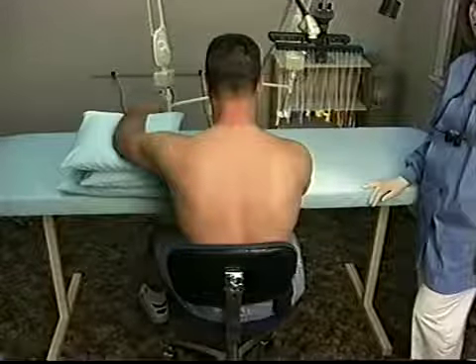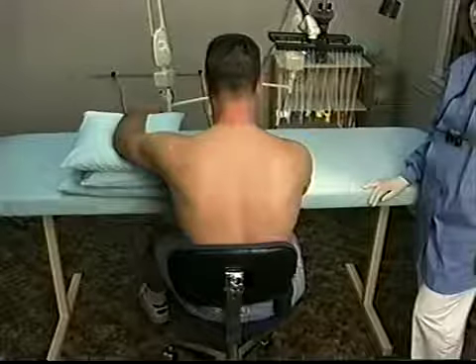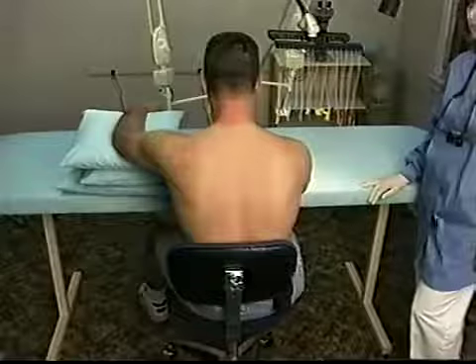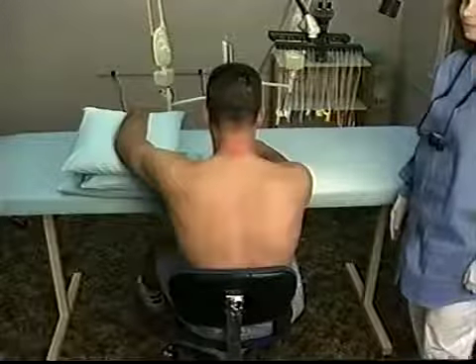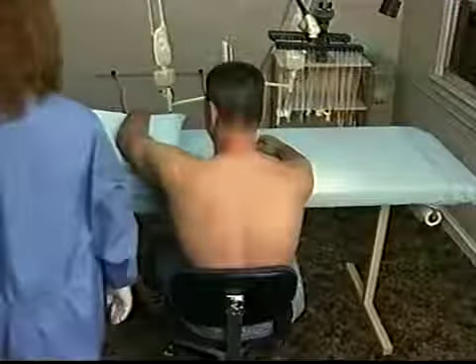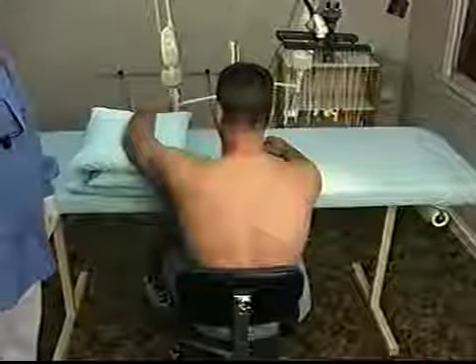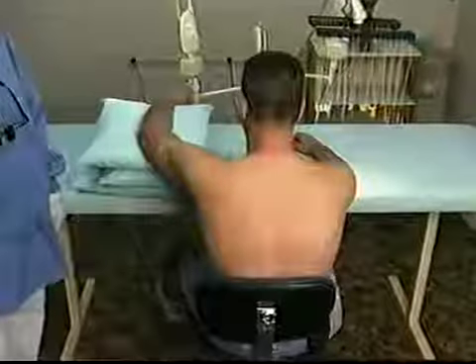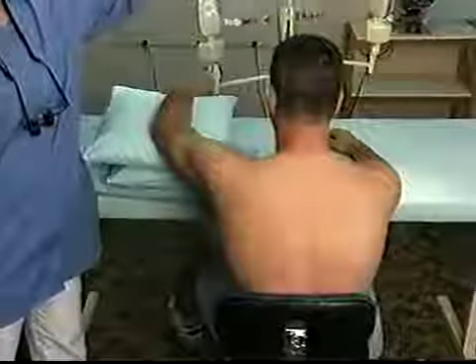For the shoulder, bring the rack and stand close to the table, and have the patient sit in a chair facing the treatment table. I prefer a hydraulic chair so that I can adjust the height. If the patient is very tall, I lower the chair, and if he is short, I raise the chair. This way, the electrologist can be comfortable to avoid fatigue. I do one shoulder at a time, then adjust the equipment for the opposite shoulder.